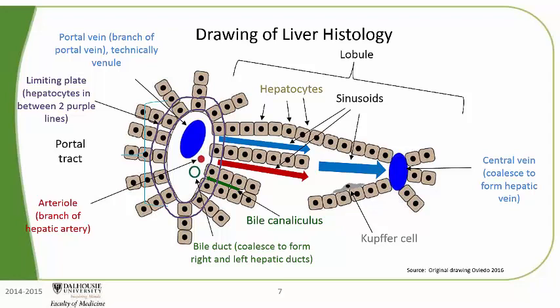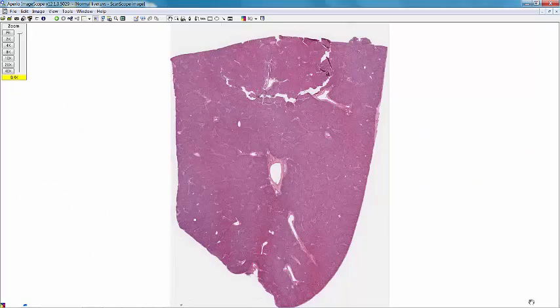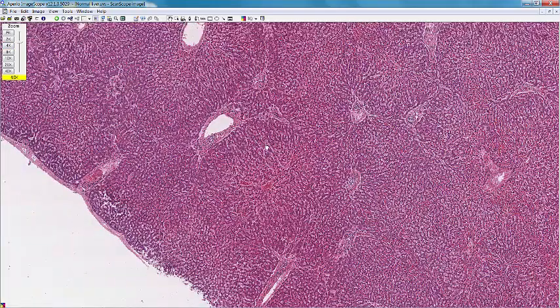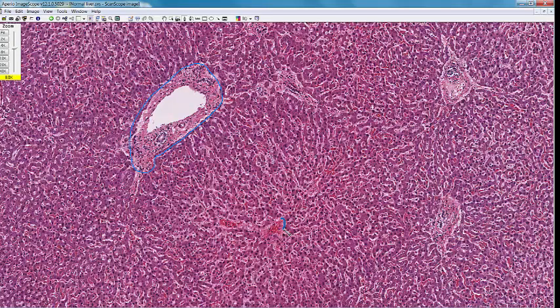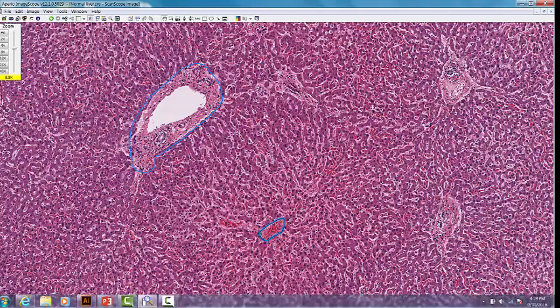Now that we have become experts on drawings of the liver, let's go on to the real liver. Here is a digital slide of a large piece of normal liver. Here in the middle of the section, you can see there is a large portal tract which I am outlining. I want to look at the liver at high power. I am going to outline the portal tract with my pen, and now I am going to outline the central vein. All the other regions correspond to the lobules. Let's look at the structures inside the portal tract.